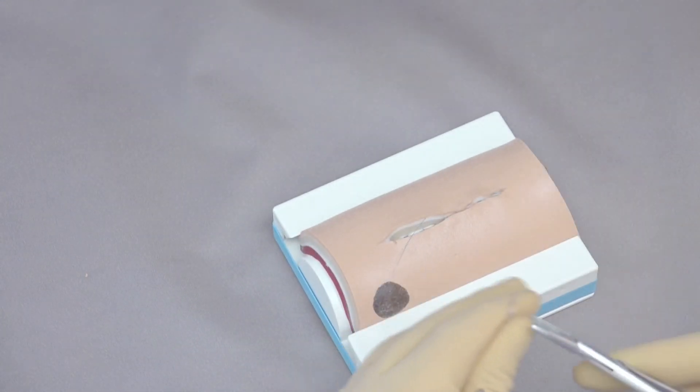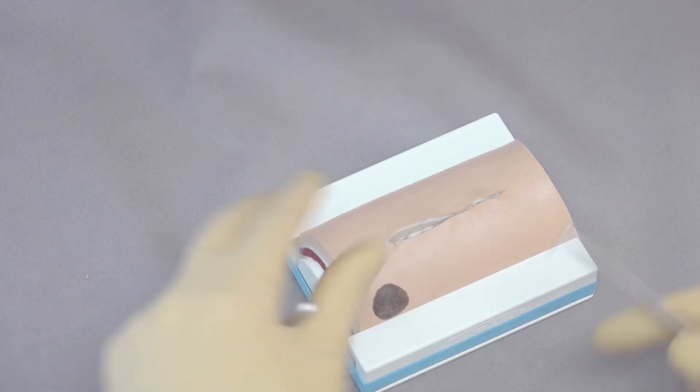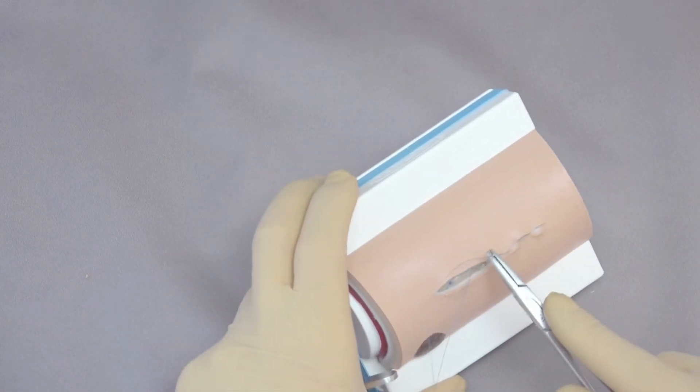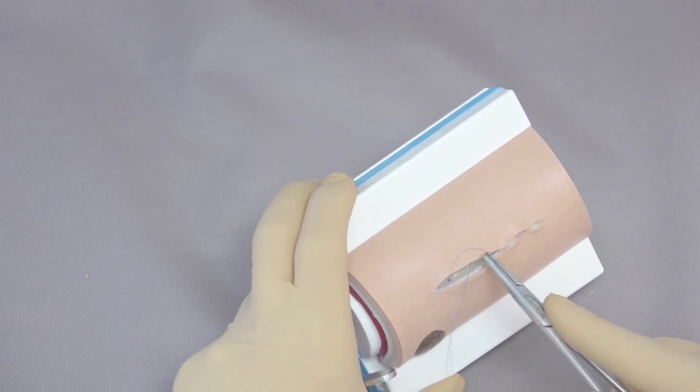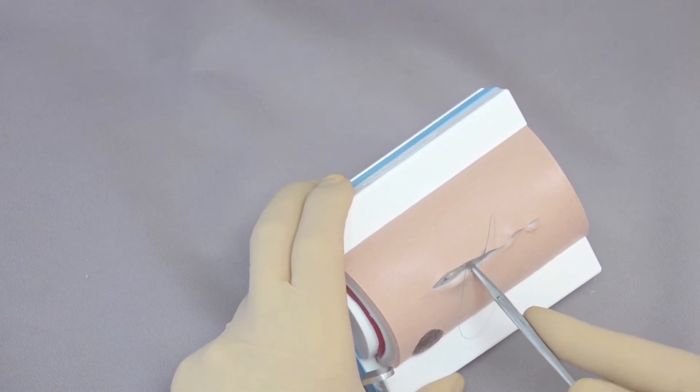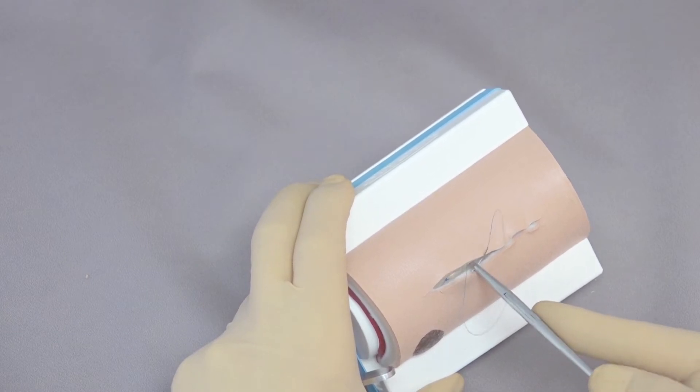Look at that, see how much better that is than when I started. So it's all part of my learning process and improving what I do so that I can make sure and get a good closure for my patients. Because the better I close them, the more functional it is, but also the more cosmetic it ends up being.